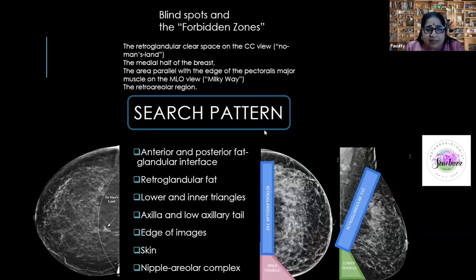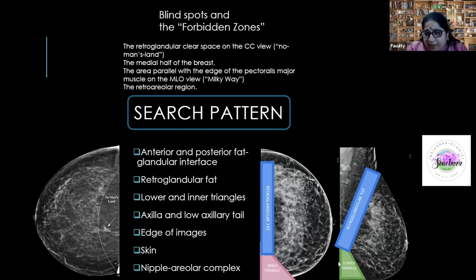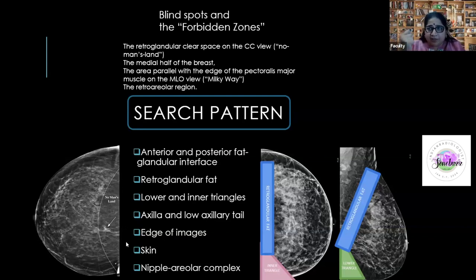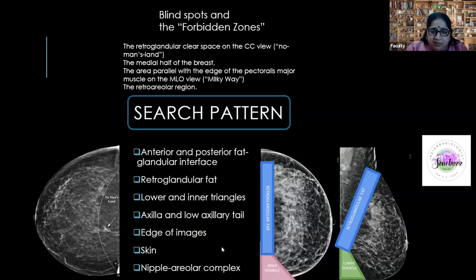To decrease the miss rate, develop a good search pattern covering areas more likely to have hidden findings. From a presentation by Monica Sheth and others, available free on Radiographics: the retroglandular fat (the 'Milky Way'), the inner triangle on CC view, the lower triangle on MLO view, the retroareolar region, 'No Man's Land' on CC, the anterior and posterior fat-fibroglandular interface, and the edges of images and skin.